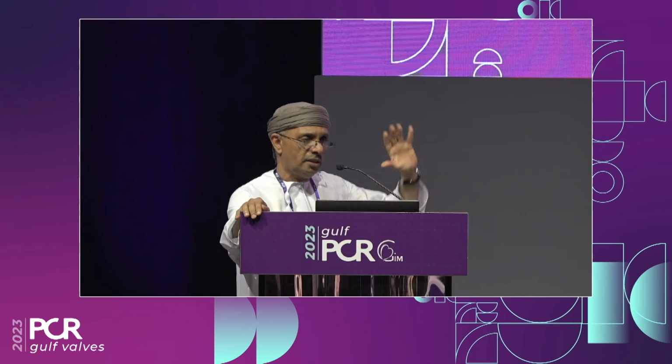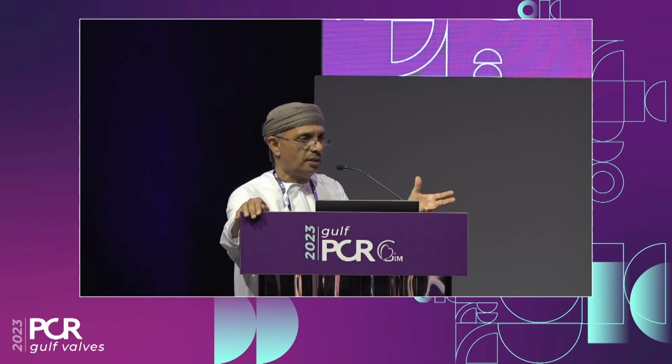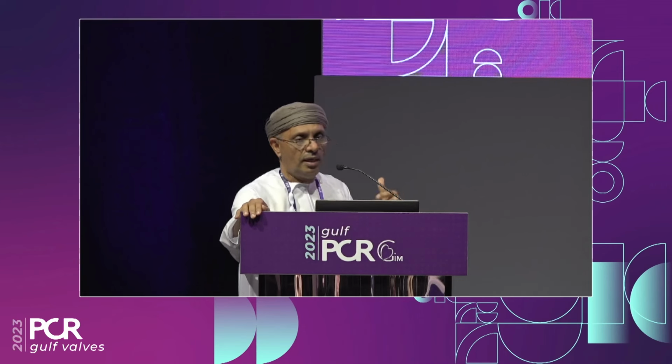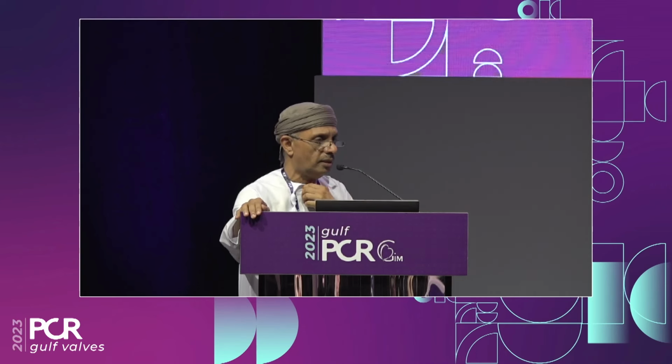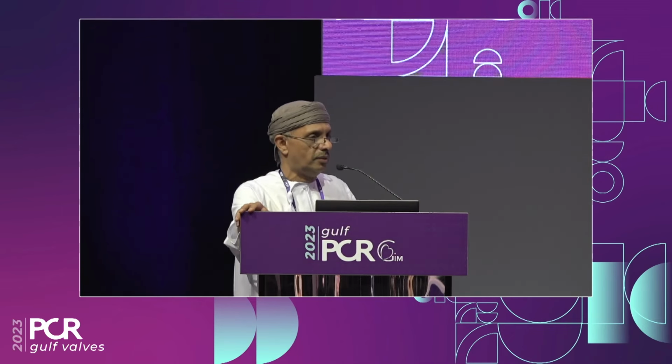Also, some of the systems will be under tension, especially if you have an angulated aorta. The moment you release, that tension relieves, and the valve pops up. This system is very flexible, and there's no tension under the system when you are deploying the valve. Now the new FX system, because it's only one spine, has some similarity with the Navitor.